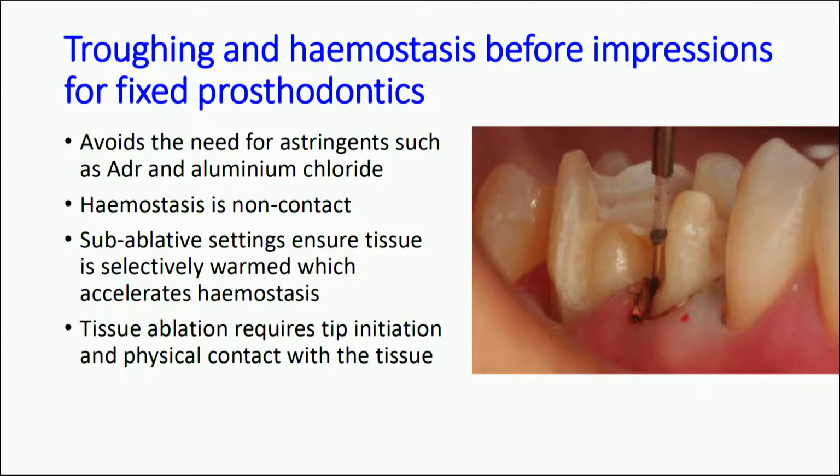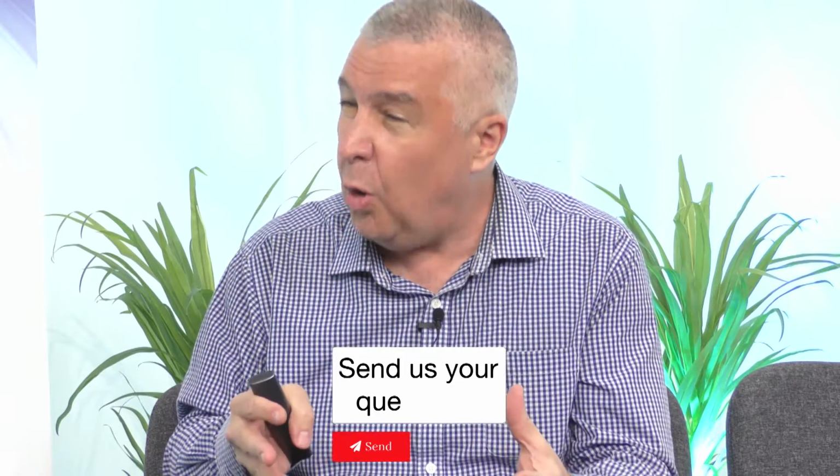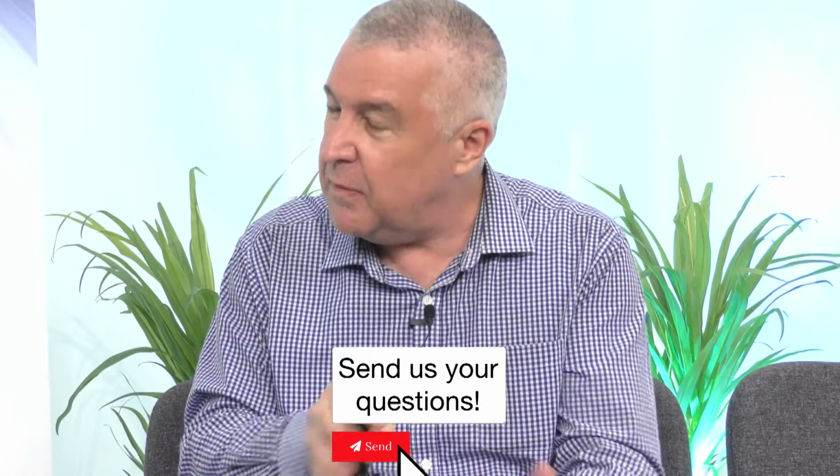Because with the diode laser, we can basically run around the patient's tissues, and we can do this as well as using, for example, cord or Expasyl, or in fact, instead of using cord or Expasyl, because we can dry the tissue up, but we can also slightly extend the contours of the crevice, which means you may not need to use cord. If the tissue is very inflamed and bleeding, you can obviously stop the bleeding by using the laser as a coagulating tool. So that's actually really versatile. And in the patients I was first treating 30 years ago, we began to explore how to optimize this specific application. We have had some questions on that front.